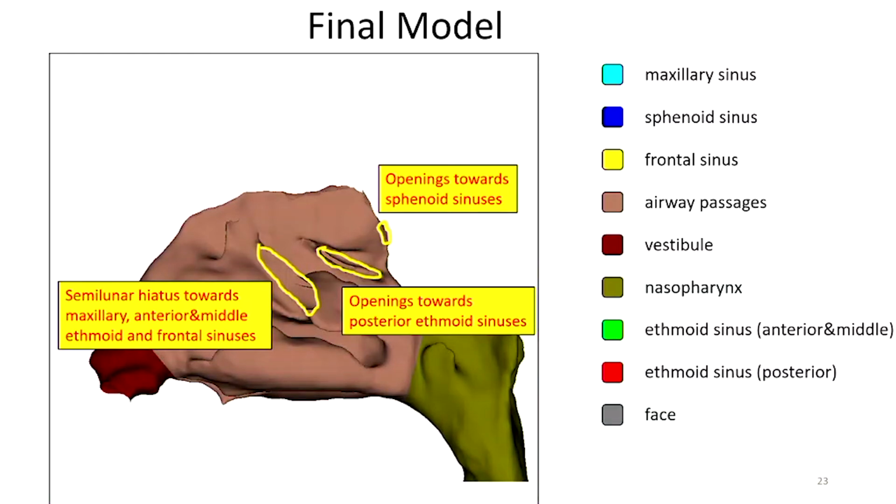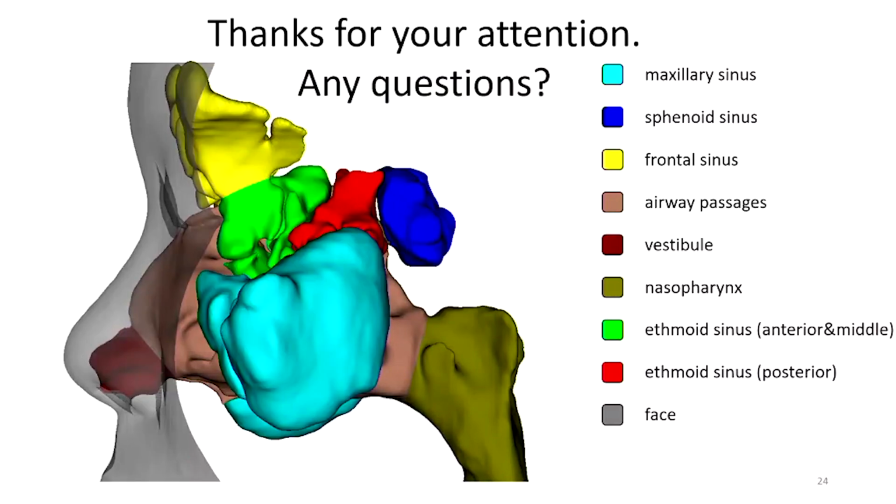Although you can see from my presentation that the segmentation is quite clean and easy, unfortunately, if you are a beginner at segmentation, it may take you a week or even a month to do this work. But if you gain enough experience, it may cost you only half a day. That's all. Any questions?